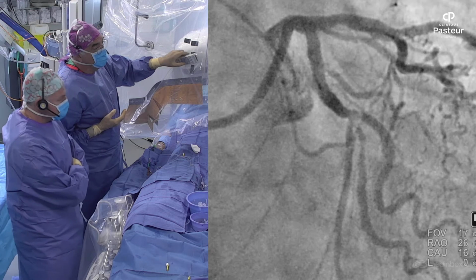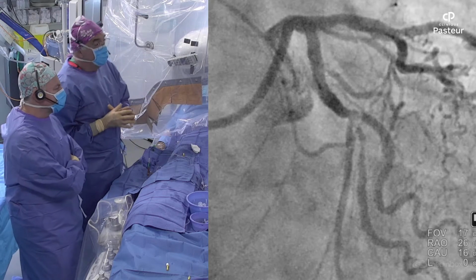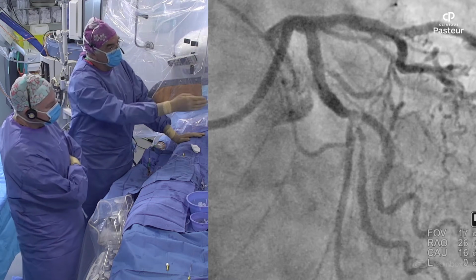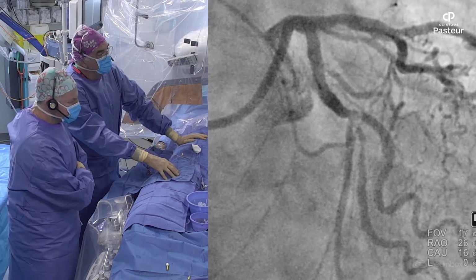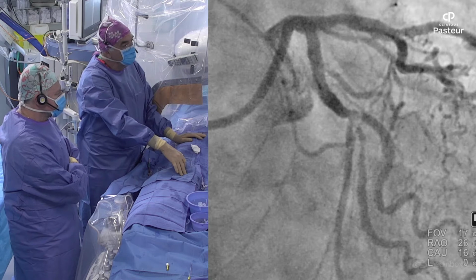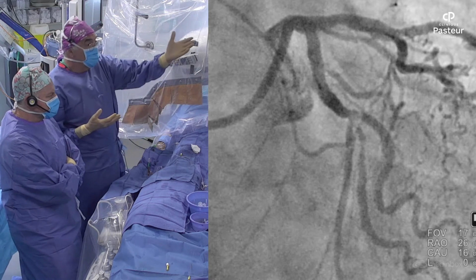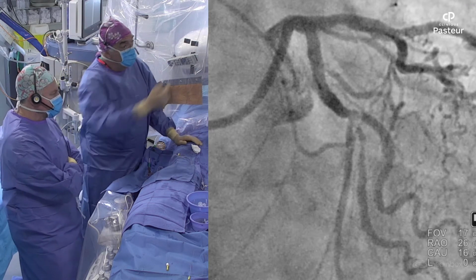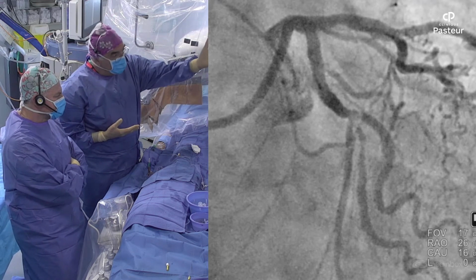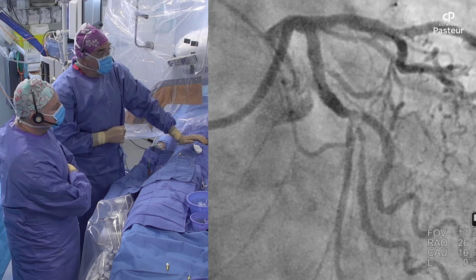We have here two possibilities. To consider the first OM as the main vessel because it looks a little bit larger, and consider the second OM as the side branch. What Bruno said, the distal circ, we will not touch it because it's a really small territory. The other option could be to consider the second OM as the main vessel. Why? Because there is a longer lesion, and we know that we will automatically have to implant a stent on the second OM and then consider the first as the side branch.